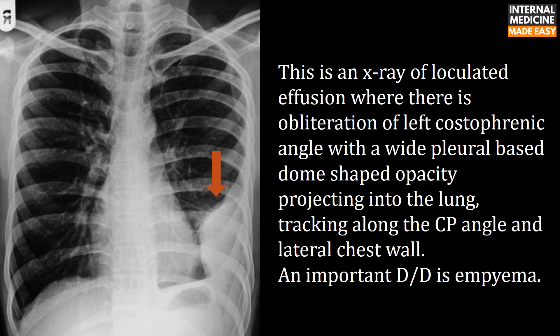This X-ray of a loculated effusion shows obliteration of the left costophrenic angle, with a wide pleural-based dome-shaped opacity projecting into the lung, tracking along the costophrenic angle and lateral chest wall. An important differential diagnosis is empyema.